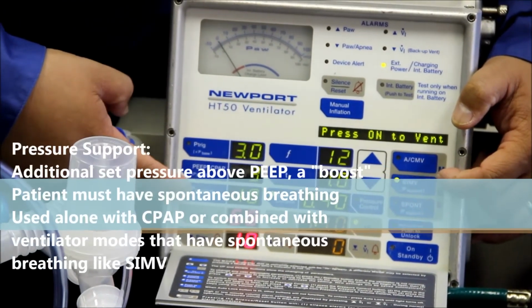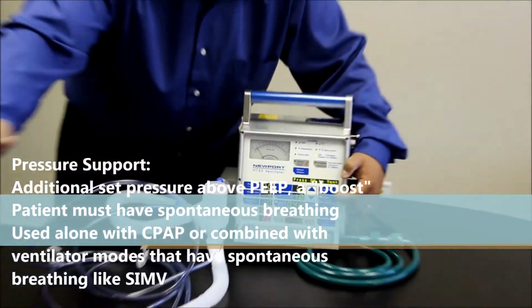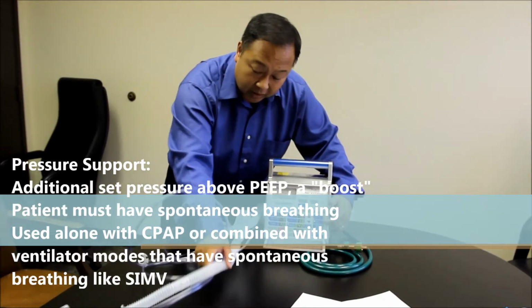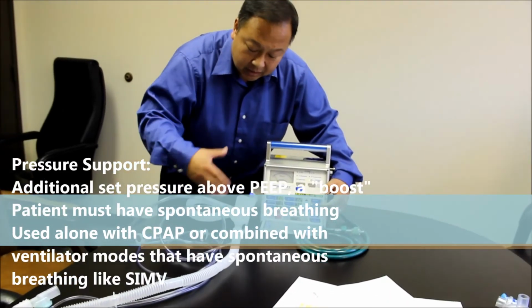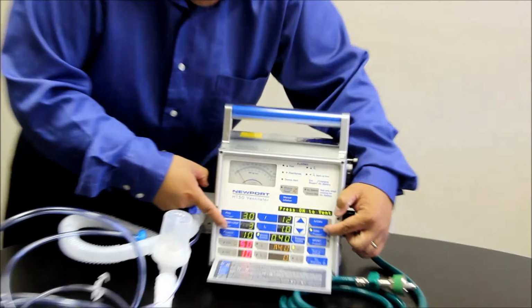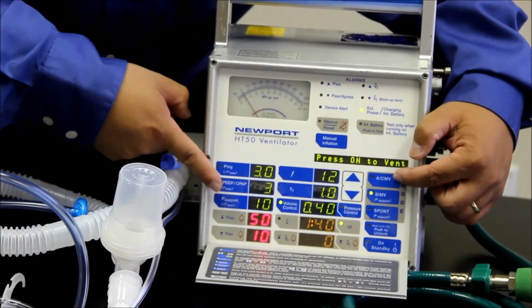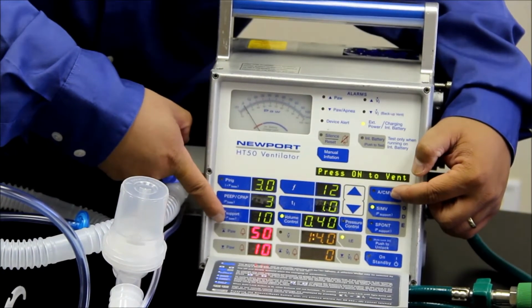The reason we need this pressure support, like I mentioned before, is to assist the patient to breathe through this entire long line of tubing, because it's very difficult to breathe through this. And so we provide pressure support to compensate for the extra amount of tubing that the patient has to breathe through. And that is only available on the SIMV mode and the spontaneous mode. It's not available for the assist control mode, because most of the time patients are sedated. They're not even going to be breathing on their own at all at that point.